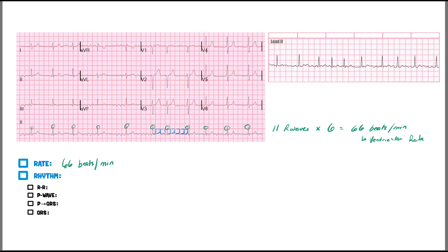This is definitely an irregular rhythm. Remember: usually if it is irregular, it's almost always AFib. There might be rare cases like multifocal atrial tachycardia, or an ectopic rhythm with aberrant conduction like PACs and PVCs, but usually it's AFib most commonly.